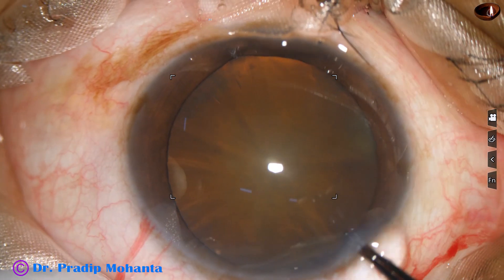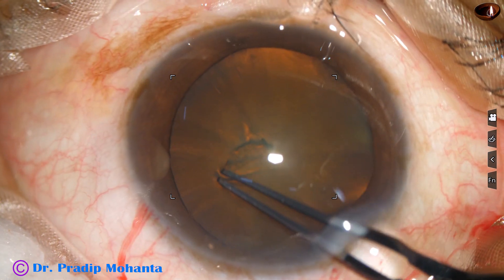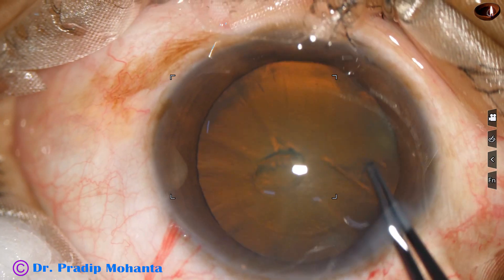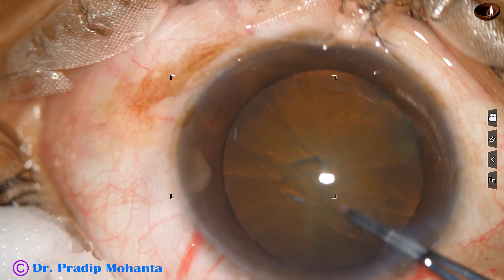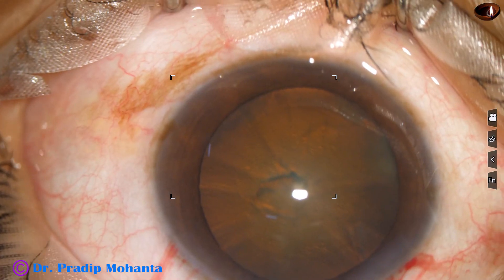This is a utrata forceps. The anterior capsule is torn at the center. A capsular tag is raised. This capsular tag is guided anticlockwise all around to get an adequate size rhexis of about 5.5 mm.